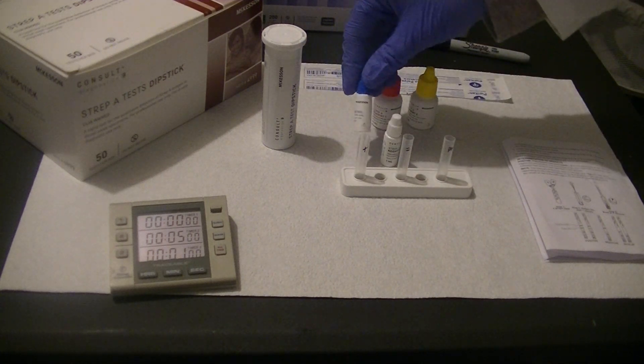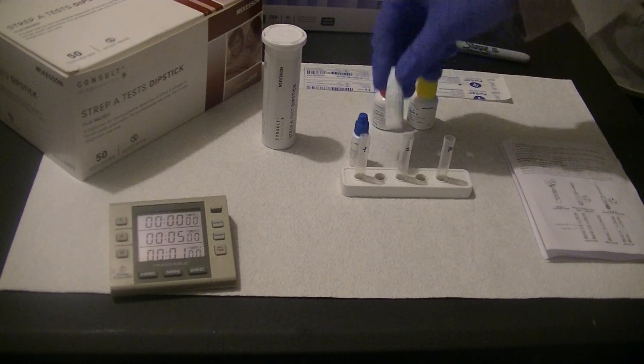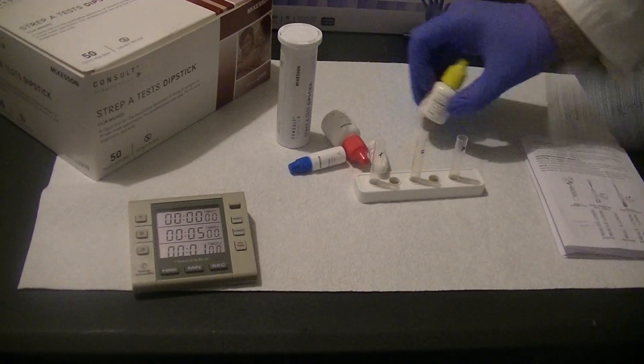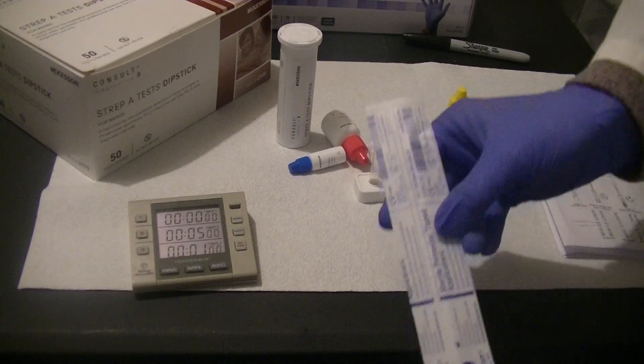I'm going to be testing a positive control, a negative control, and I'm going to test myself by swabbing my own throat.